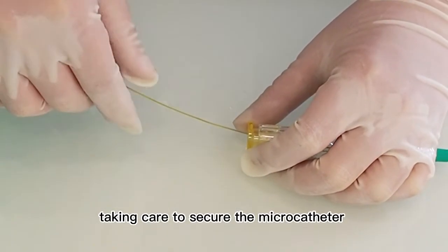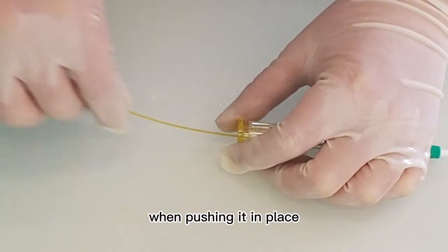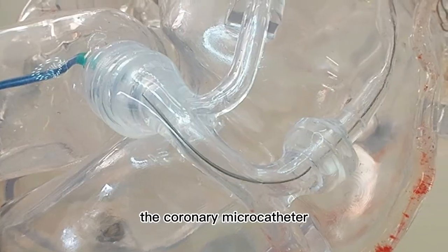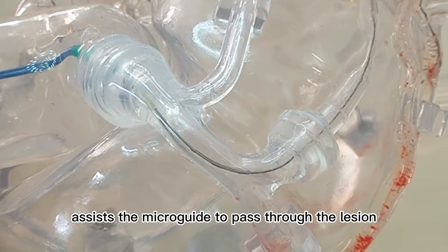Take care to secure the microcatheter when pushing it in place. For the treatment of common lesions, the coronary microcatheter assists the microguide to pass through the lesion.